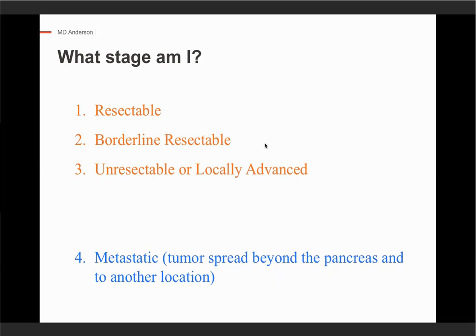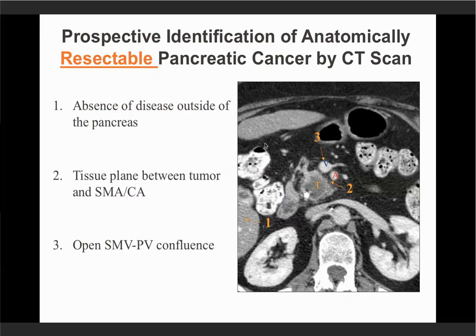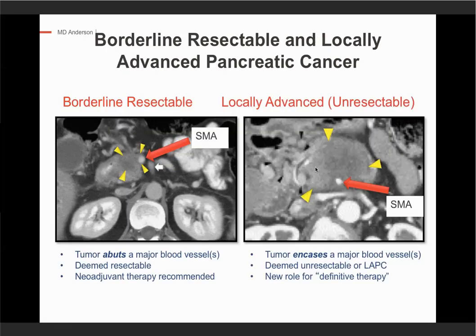Historically, we didn't talk about metastatic disease and radiation, but there's some exciting work being done where radiation may have a larger role. So as I mentioned, in a situation where a tumor is considered resectable, you could see the tumor right here. It's a hypodense area. And then you can see the vein, which is usually the larger vessel. This is superior mesenteric vein. And then this is the superior mesenteric artery. And you could see there's a clear plane. You could see a dark color between that, suggesting that there's no involvement. So by definition, this patient can undergo upfront surgery.